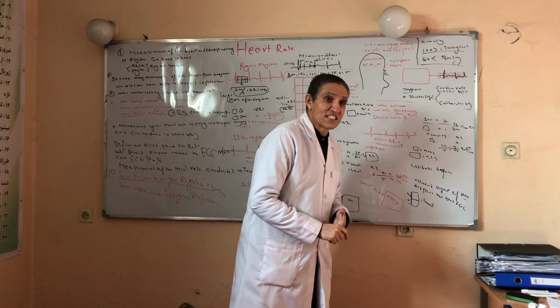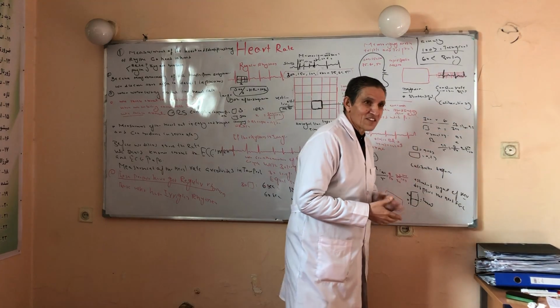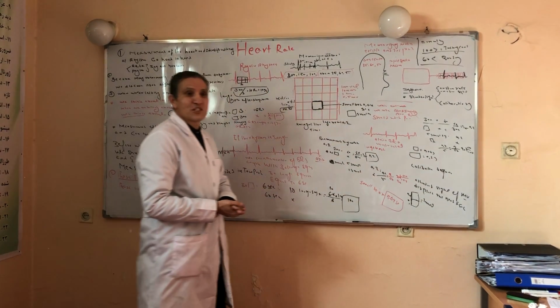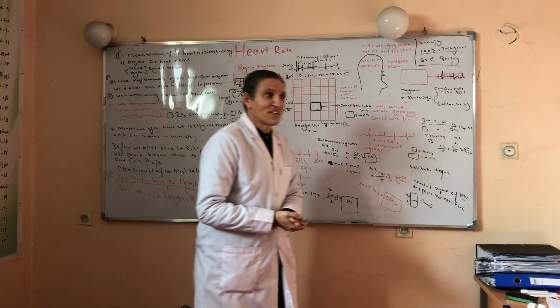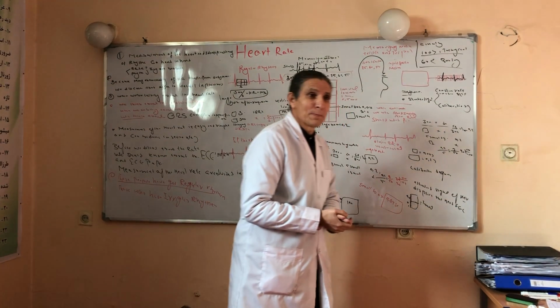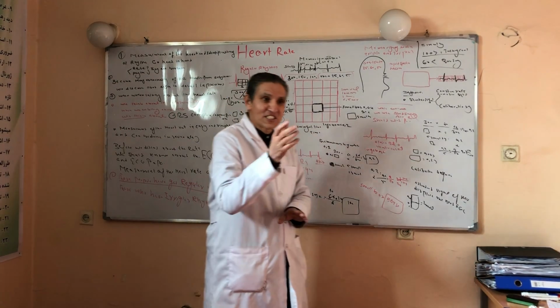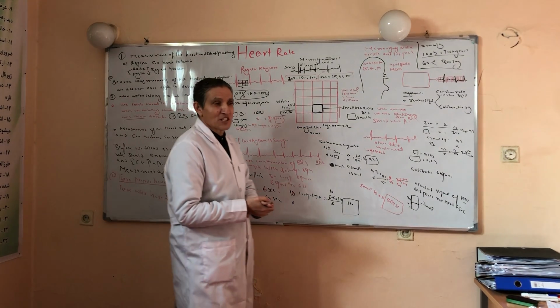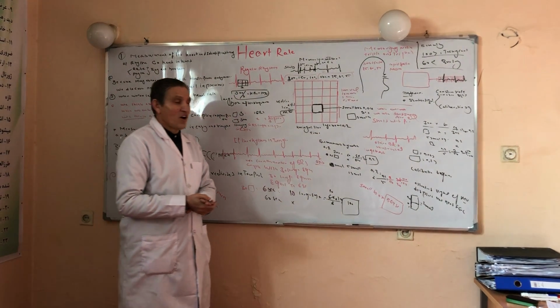Standardization of the ECG machine is characterized by two things. One is constant rate, another is calibration signal. What does constant rate mean? It means all ECG machines are adjusted in such a way that 300 large squares move under the needle of the ECG machine within 60 seconds. So 60 seconds equals 1 minute, or vice versa. In addition, when 5 large squares move under the needle of the ECG machine, it takes 1 second, or vice versa.